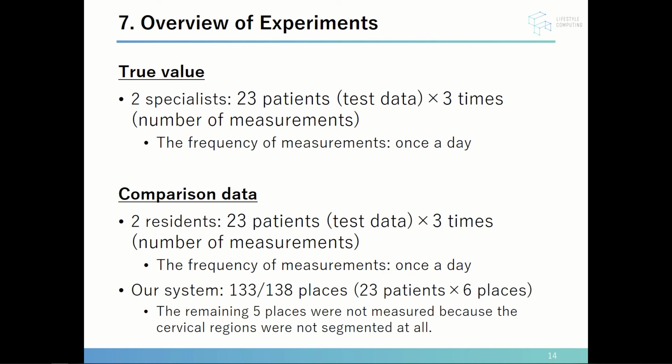The true value was measured 69 times by 2 specialists, 23 images 3 times. The frequency of measurement was limited to once a day and was not continuous.